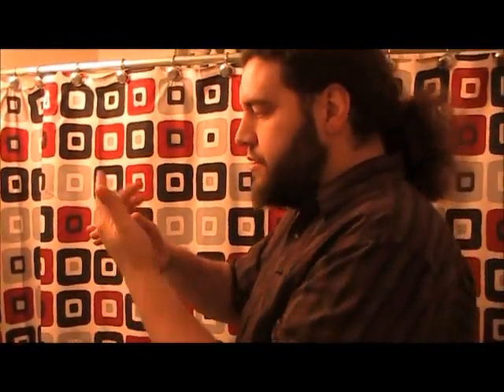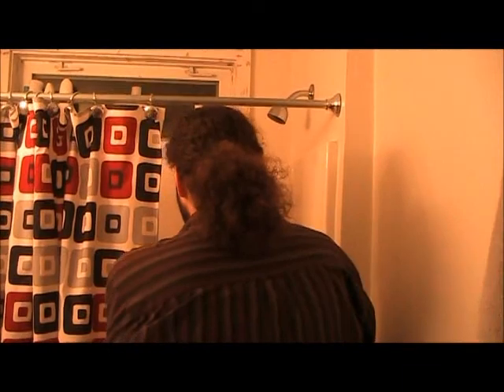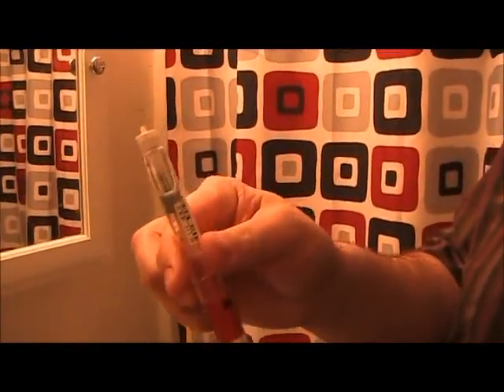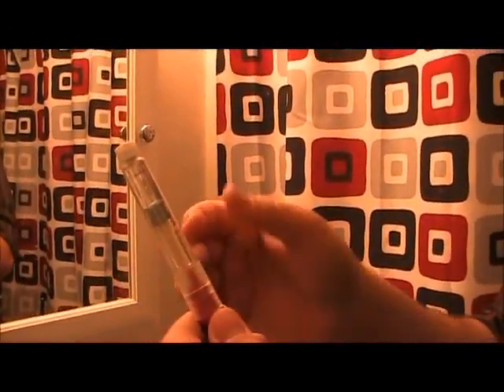To prime it, you want to discharge this 37.5 — you can see a little bit beading at the top already. I'm going to blast this into the tub because you don't want Lupron on your toothbrushes or anything. I saw one video online where it was like a full stream, and I think they were just trying to demonstrate getting some of the drug out. But every time we've primed these, it's only been a few drops. So don't freak out if not a whole lot comes out, because you don't really want to waste this stuff — I'm sure a lot of you probably have to pay for this out of pocket, and it's not a good thing to waste.